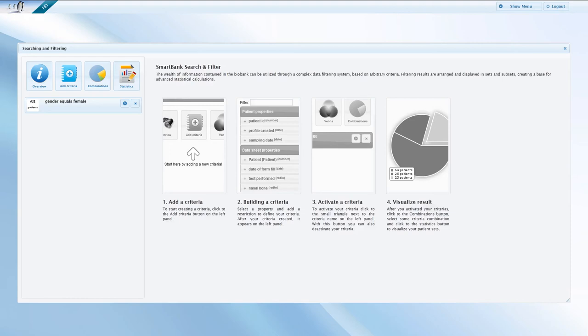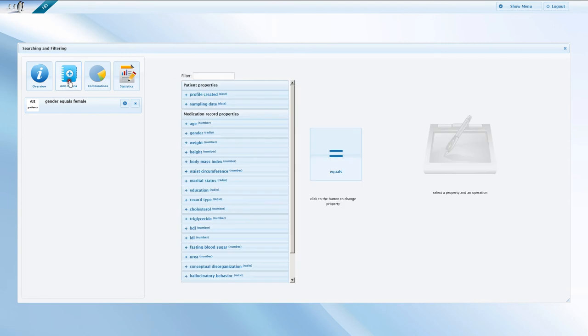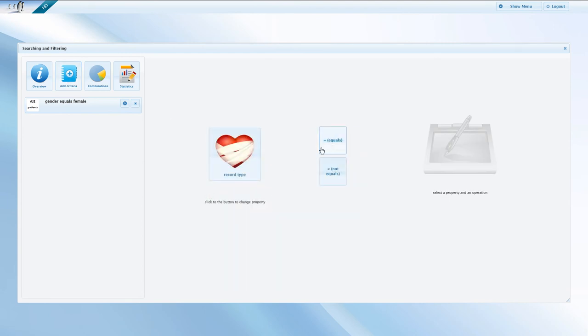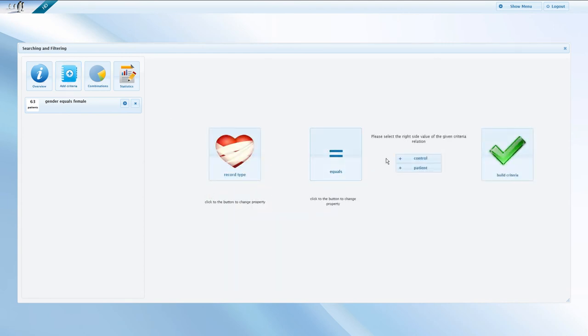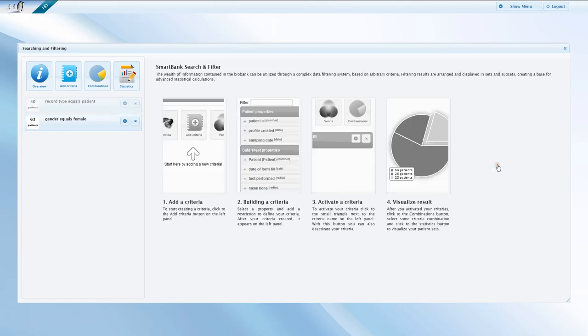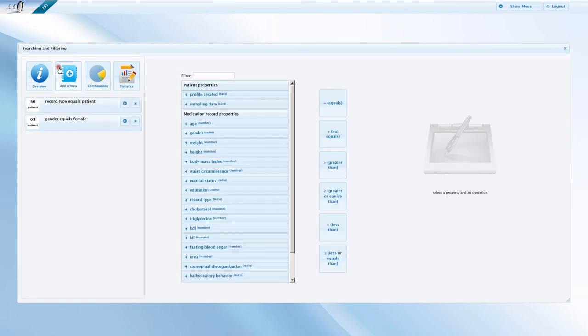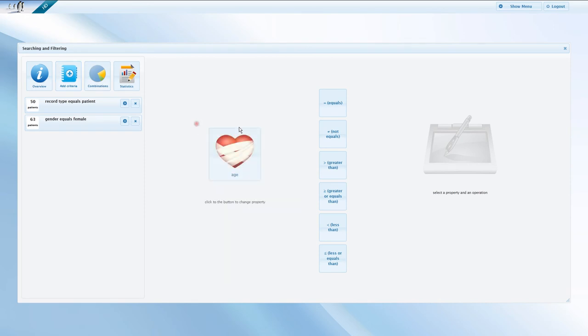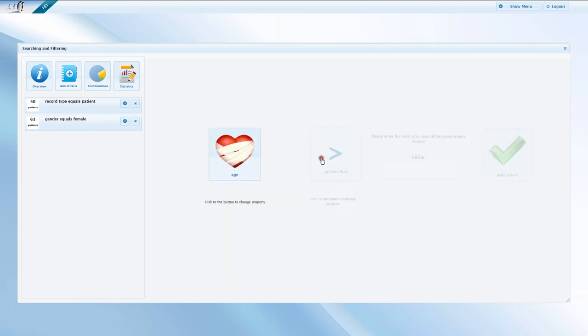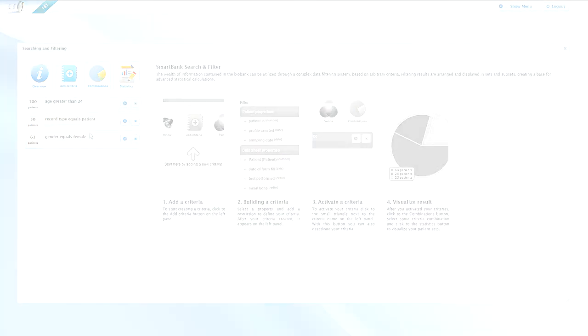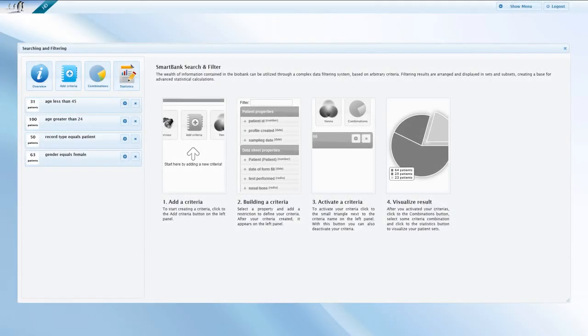Let us add a second criteria. This time, we do not start typing but pick record type from the list. Let us choose Patients over Controls and build a second criteria. Our third and fourth criteria are age-related. Let us suppose we are only interested in patients who are more than 24 but less than 45 years old.